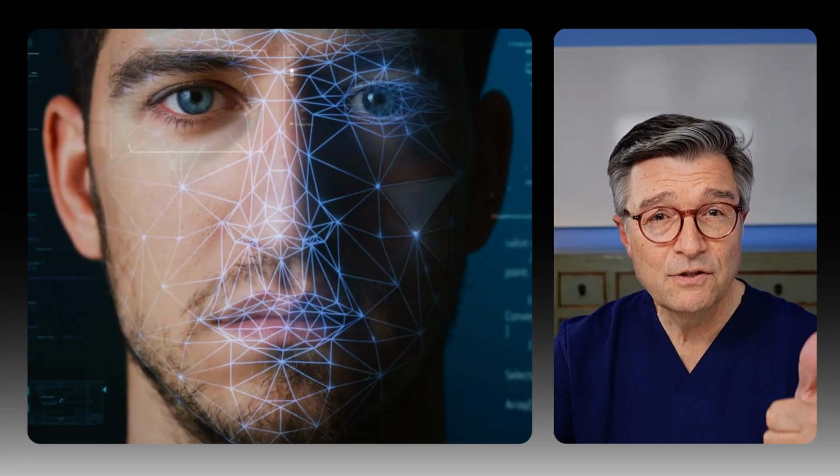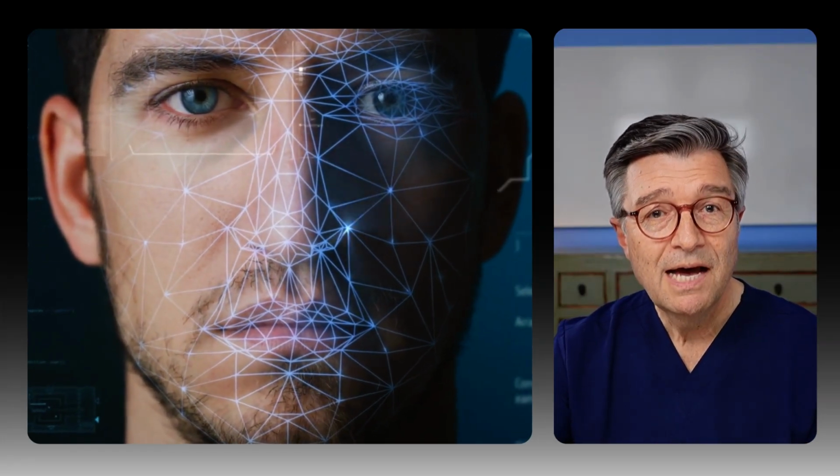And when combined with video smile analysis, we can observe how teeth show during speech, how the lips move during various expressions, how the smile changes in different emotional contexts. This allows us to create treatment plans that respect not just function, but also aesthetics, individuality, and emotion. Face scans and smile dynamics transform our planning from static to dynamic, from tooth-centered to patient-centered.